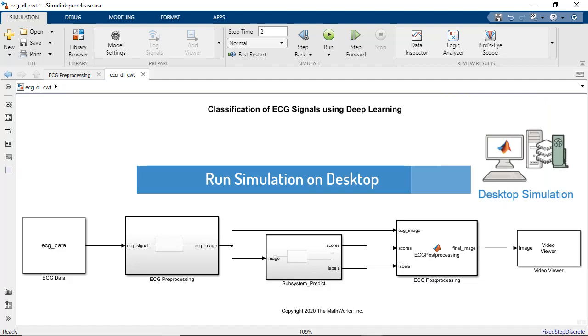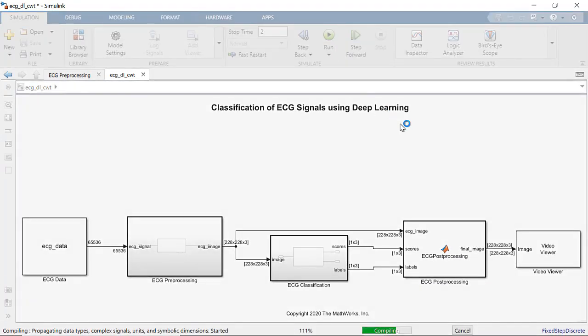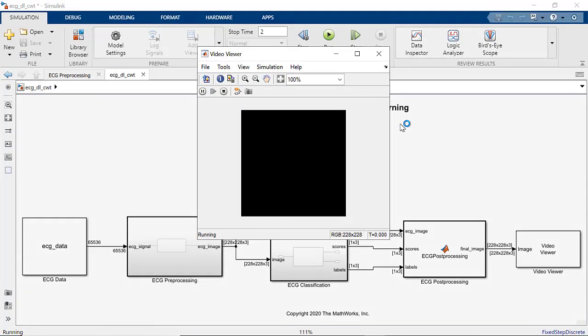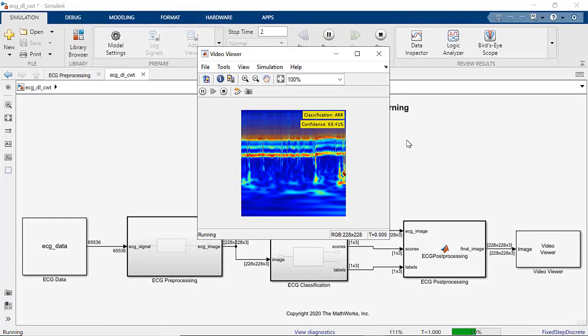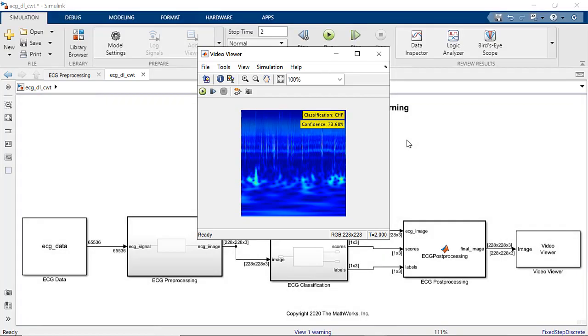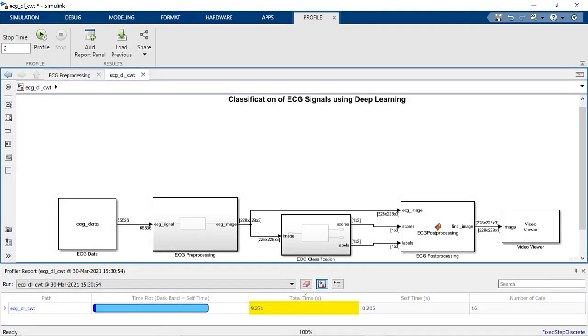Let's go ahead and start the simulation. We are currently running the simulation on the CPU and we can see that SqueezeNet is able to classify the ECG data and show the confidence scores. Execution time is about 9.2 seconds.